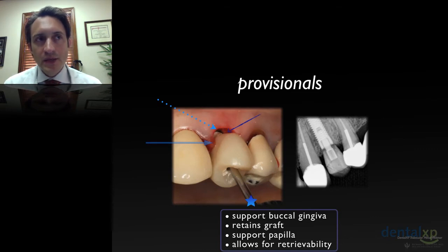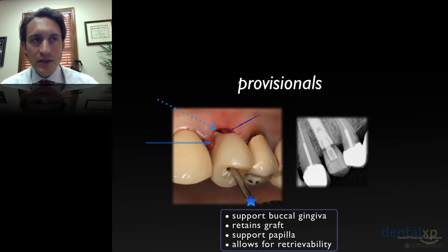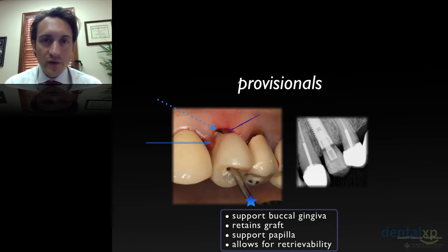In premolar cases, there's a number of different techniques I'll use for premolars. There's something called pro-temp crowns, which are basically a partially cured composite resin type crown, which is very easy to work with from a surgical perspective, and I will use those oftentimes in the premolar areas. Also, denture teeth work very well. I'll just take off the working cusp and utilize the nice facial anatomy of denture teeth.